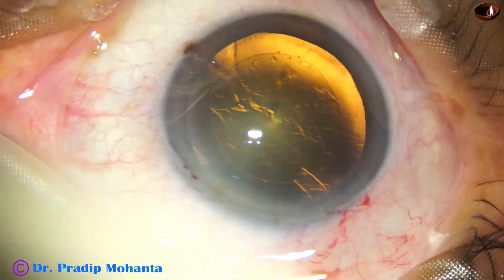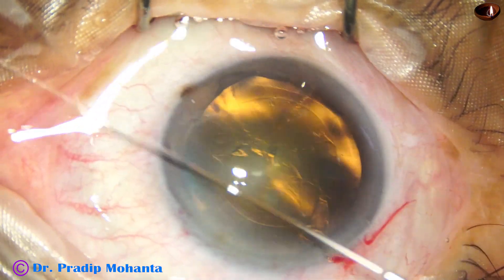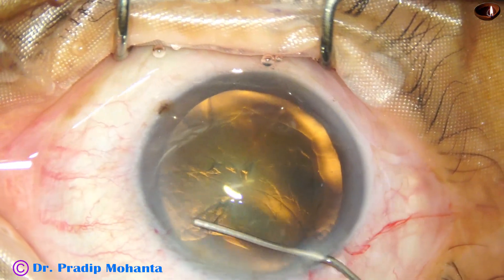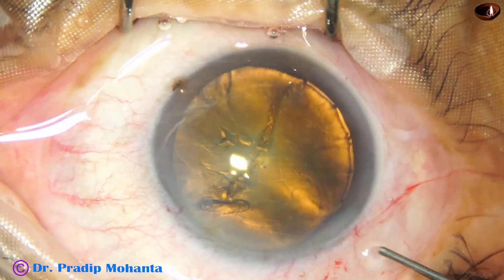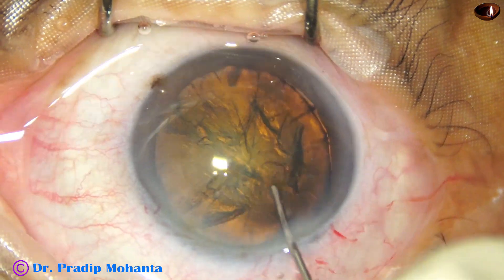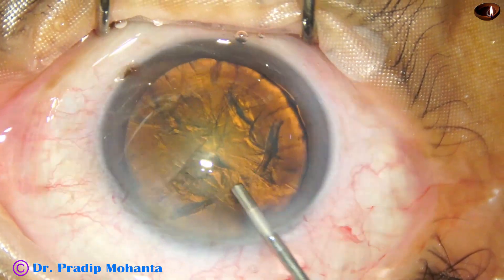Capsulorhexis is done with the help of the Utrata forceps, and now hydrodissection is done with BSS using a 27-gauge cannula. As the fluid wave goes to the other side we stop injecting, depress the nucleus, and just rotate once because I am going to use a pre-chopper.